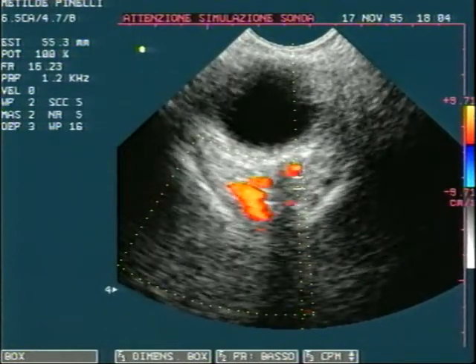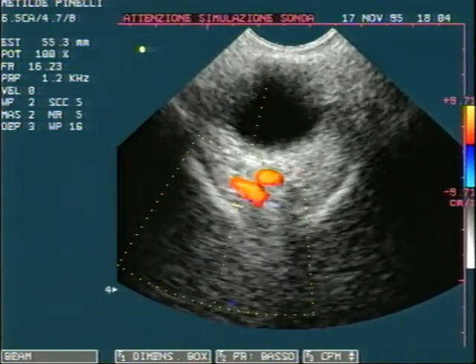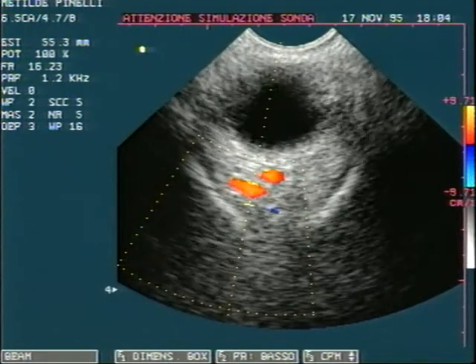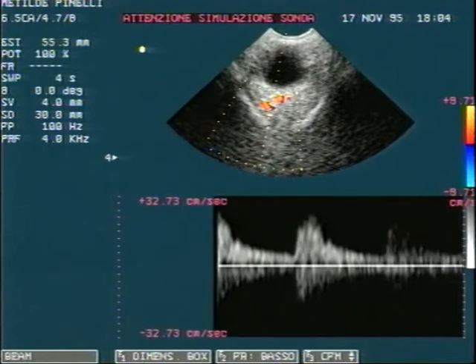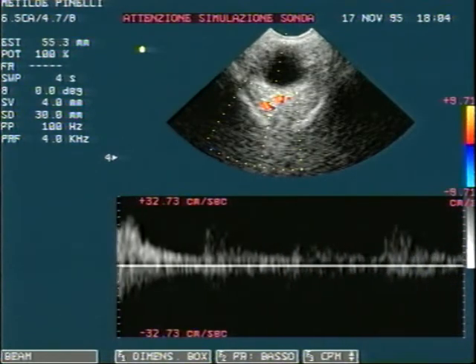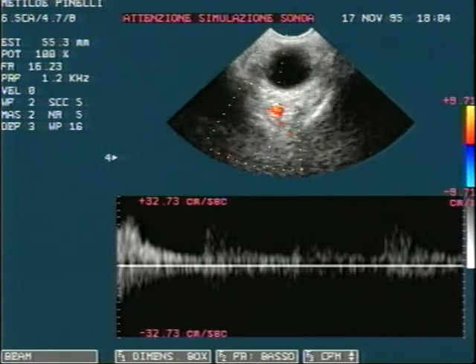The color Doppler is a non-invasive method to investigate the venous and arterial vessels of the ocular bulb, permitting an accurate and reproducible measurement of the flow velocity and resistive index. The venous and arterial vascularization within the orbital cone are here visible on an axial plane.